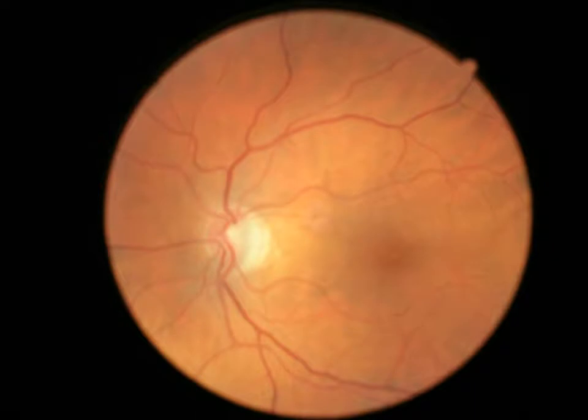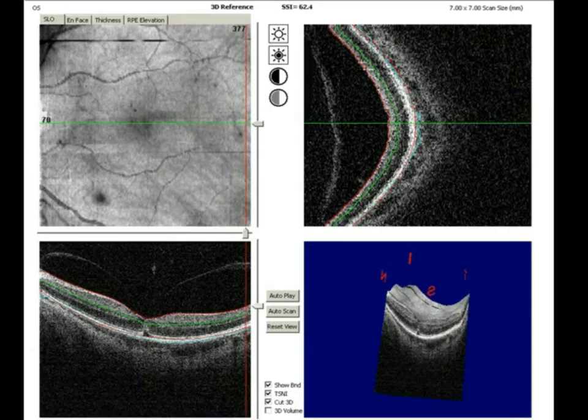Again, I challenge you when you look at this picture in particular: best corrected visual acuity of 20/30, and we're not sure why, and we're looking at the retina. And this is actually an unfair advantage that I'm giving you as the viewer, because you're looking at a fundus photo, which isn't really what we're looking at when we're viewing these individuals in our offices and in our clinics. But when we run an OCT scan, we see very quickly what's going on, and it becomes very telling.